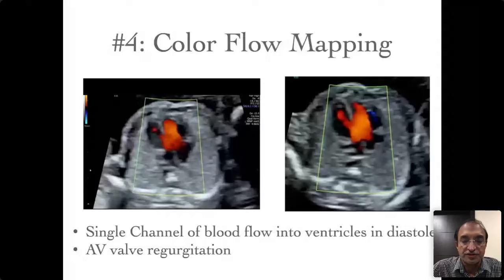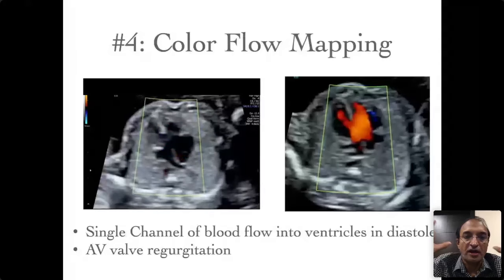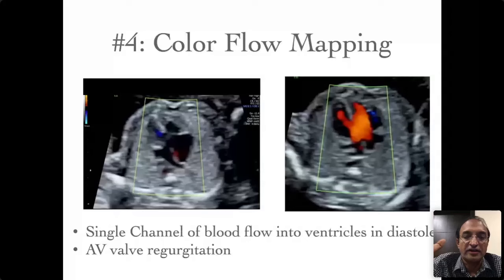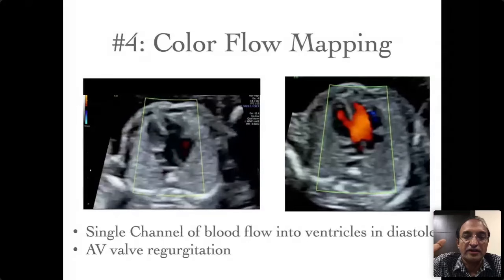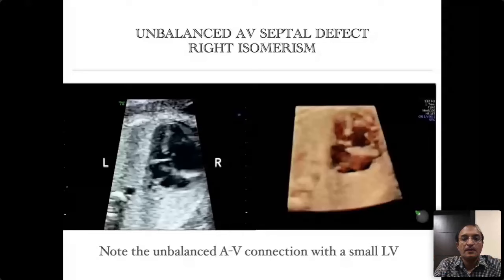The two important imaging points for AV septal defect are: in the diastolic frame you find a large defect in the center — the crux — of the heart, and in the systolic frame you see loss of offsetting or linear insertion of the valves. The entity just shown was a balanced AV septal defect where the two ventricles were equal-sized.